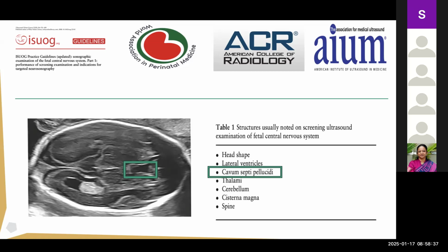But before that, Seneesh, do you want to answer that question? Well, partial septal agenesis is a very difficult diagnosis prenatally. Possible theoretically. And the general line of counseling is the same. Look for additional CNS abnormalities. Look for the CC, look for ventriculomegaly. In general, do a detailed neurosonogram and look for any additional findings. The counseling would be almost on the same lines. There are no distinctive figures available which differentiate the counseling for partial versus complete agenesis of septum pellucidum.